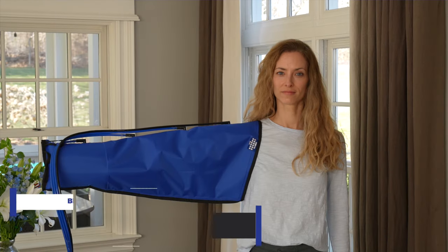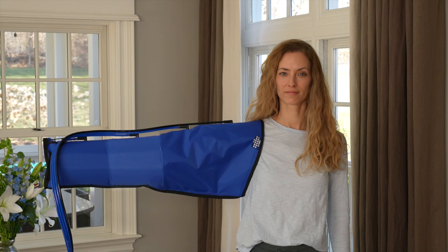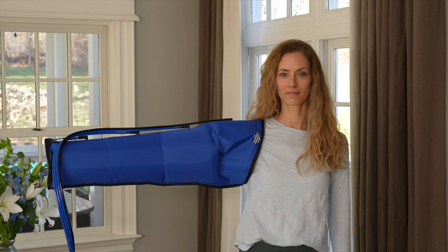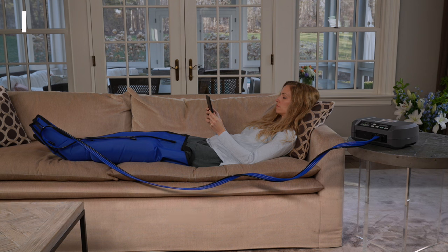Once set, the pump will automatically inflate each chamber to the proper pressure. Sequential pumps with gradient pressure have proven to be the best devices for reducing the amount of excess fluid in a limb in a comfortable and efficient manner. Our pumps mimic the action of your own body by providing a pumping action from distal to proximal, allowing excess fluids to be reabsorbed by your body — thus providing reduced pain, improved lymphatic and vascular flow, wound healing, prevention of infection, effective prophylaxis for venous thrombosis, and reduced dynamic edema, all while improving your quality of life.